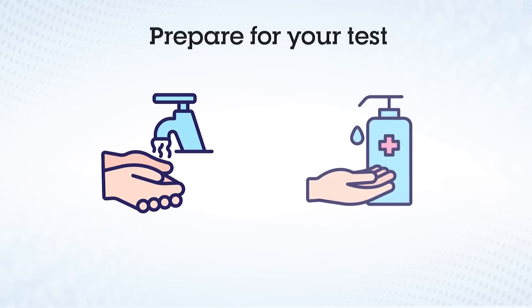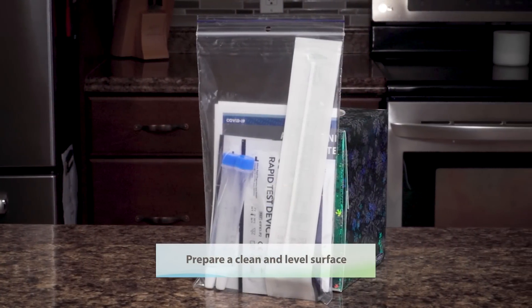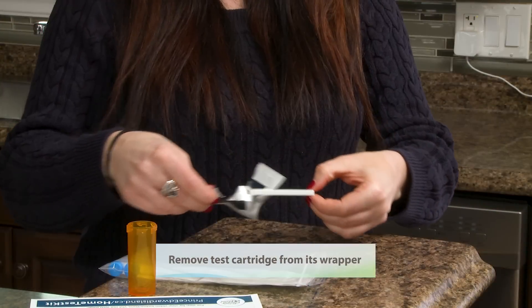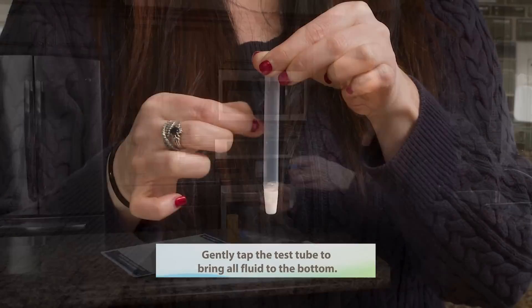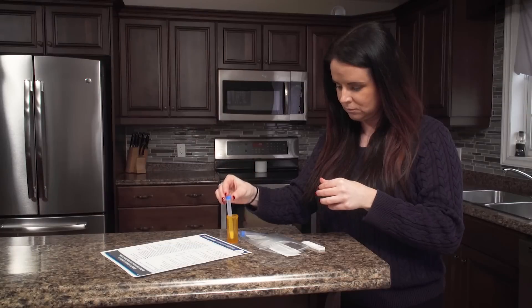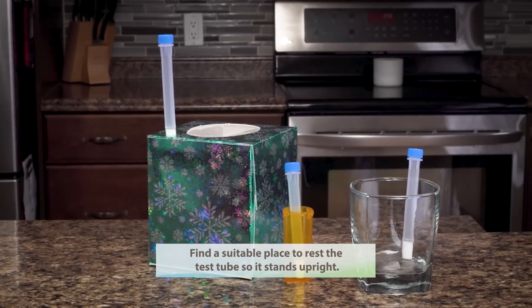Prepare for your test. Wash or sanitize hands. Prepare a clean and level surface. Remove test cartridge from its wrapper. Gently tap the test tube to bring all fluid to the bottom. Find a suitable place to rest the test tube so it stands upright.